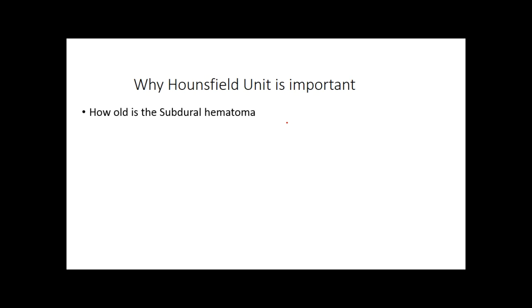Why is the Hounsfield unit important? For example, if you want to compare the age of a subdural hematoma, how old is it in days? You can know by the Hounsfield number. If you want to differentiate between a blood vessel which is injected with contrast media and a calcification, you can know by viewing the Hounsfield unit.